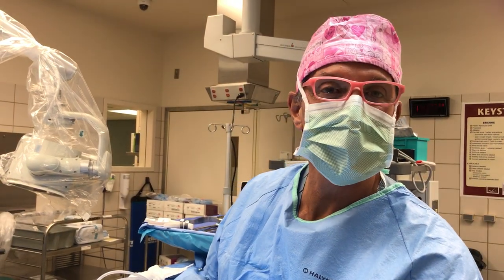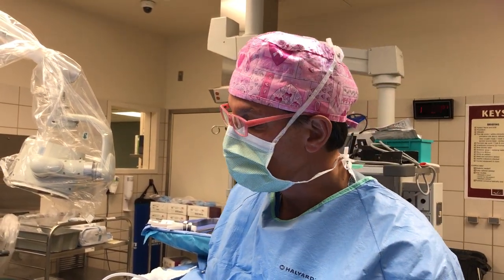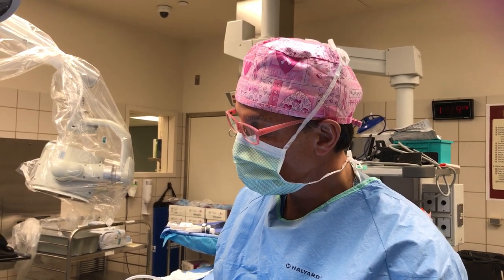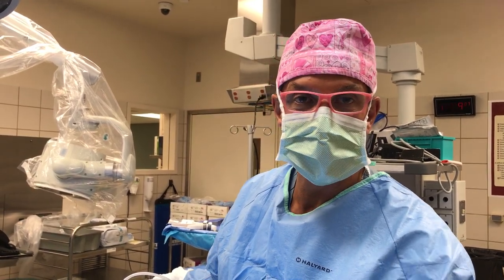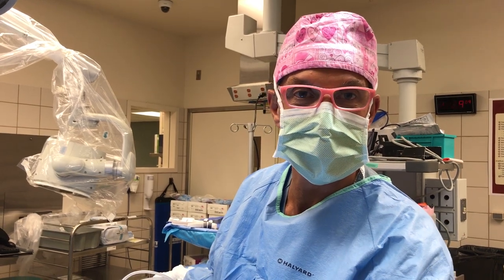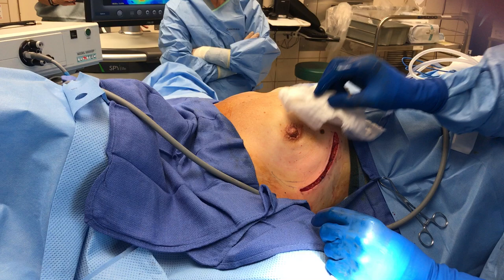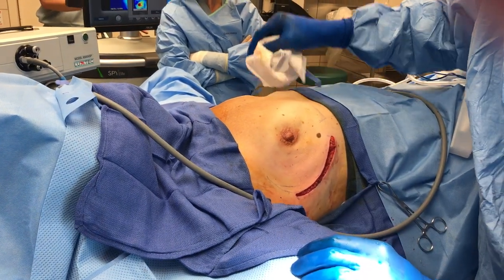Dr. Brown did nipple-sparing mastectomy. You can see we did the SPY — as the video will show, the nipple areola complex is lit up and the soft tissue is lit up. You can see the nice vascularity: pink nipple over here.